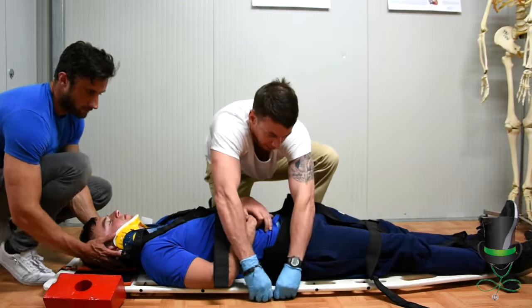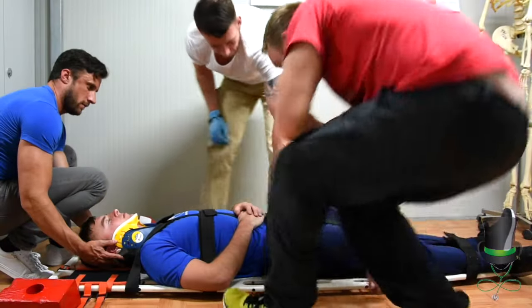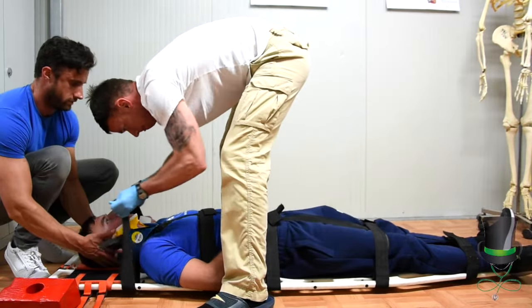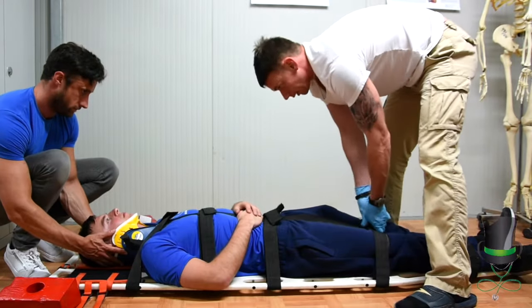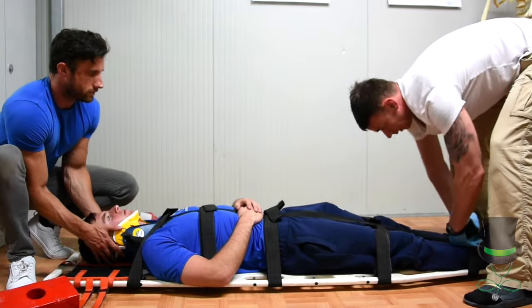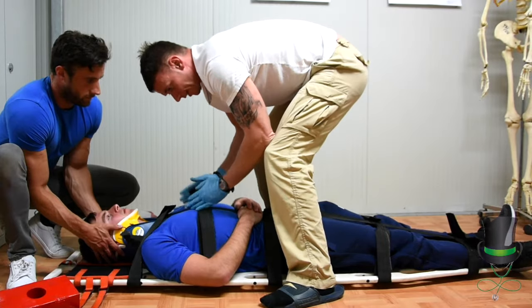We start with the hips and begin the strapping process, with your pre-hospital provider on the other side. We've tightened the hip straps first, followed by the shoulder straps. If the patient starts to vomit, we are able to log roll the patient to allow for postural drainage. Then onto the legs and then the lower ankles. The last strap to be tightened would be the chest strap — get the patient to breathe in. This ensures he has proper chest clearance for when he wants to breathe.